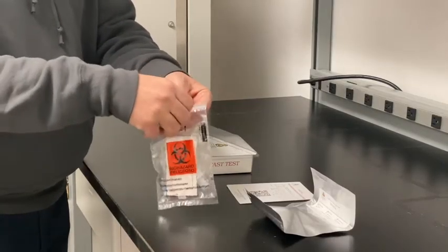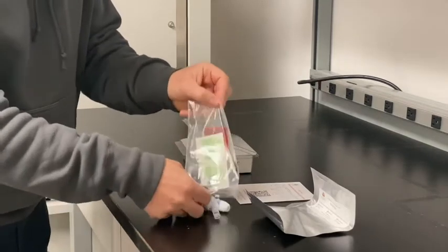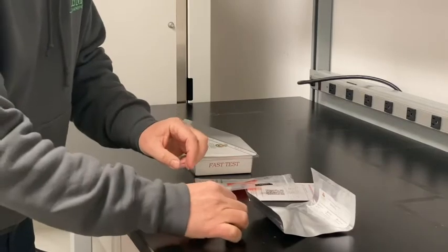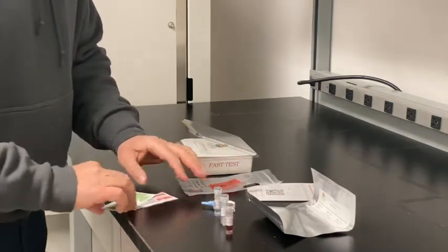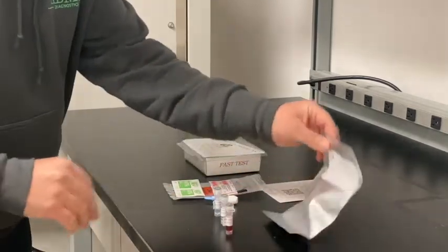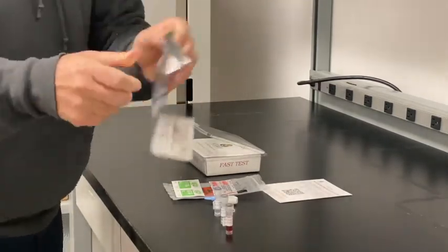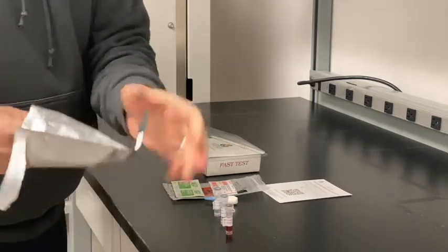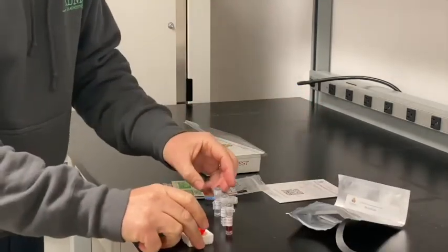The first thing you'll want to do is open the biohazard bag and remove the contents. You should have three vials, alcohol wipes, a band-aid, and a lancet. Make sure all the components are available. The first thing you'll do is open the foil pouch and remove the rapid test device. Set the device on a level surface.